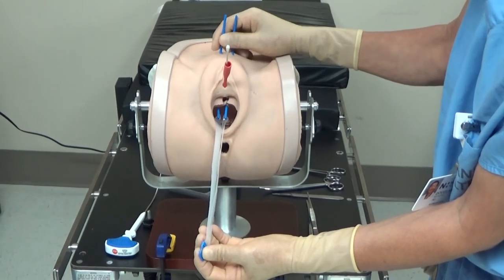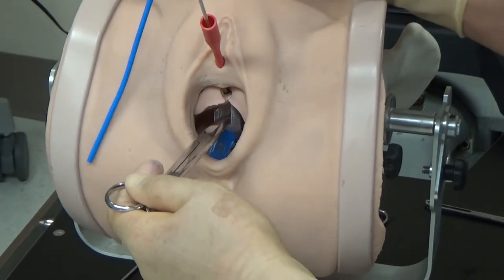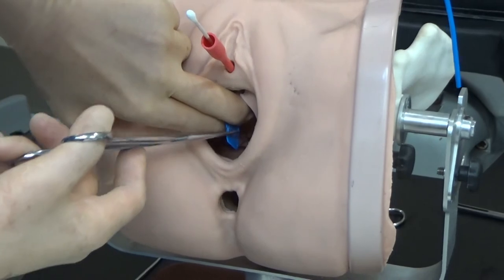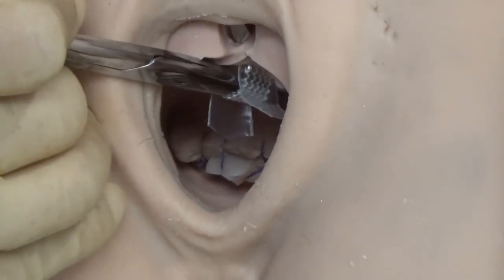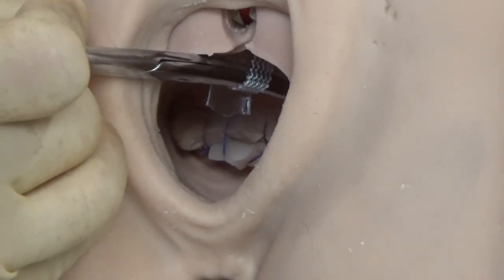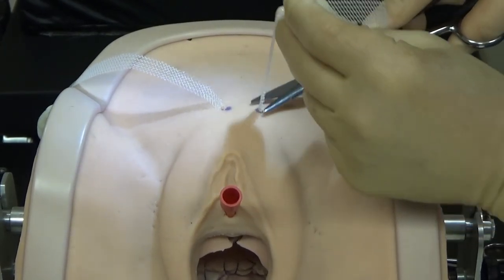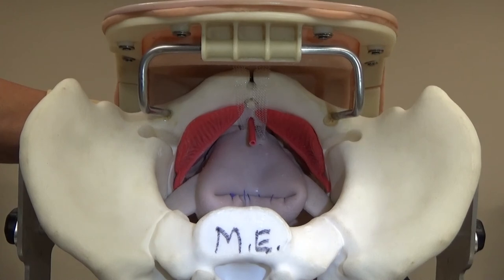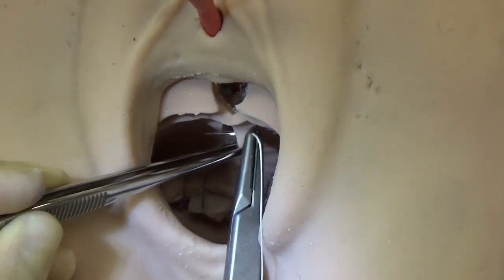The sling is then pulled up from the suprapubic sites and placed tension-free underneath the midurethra, and a spacer is used as seen here. The centering tab is then cut, which releases the plastic sheaths, and some countertraction will be necessary to prevent migration of your perfect sling placement. Excess sling is then cut below the level of the skin. Proper sling placement can be easily checked on the model. The full thickness vaginal wall incision is then closed with the absorbable suture of choice.